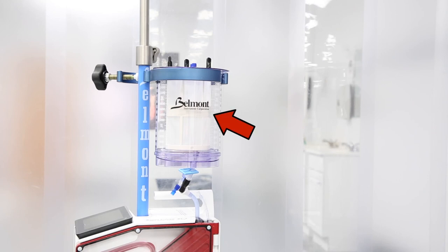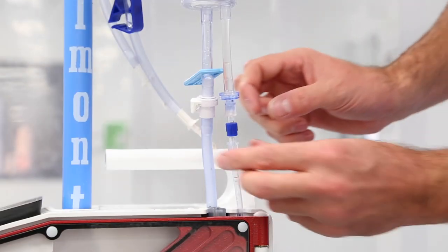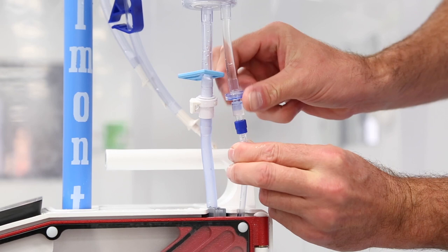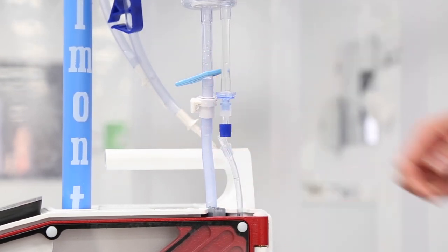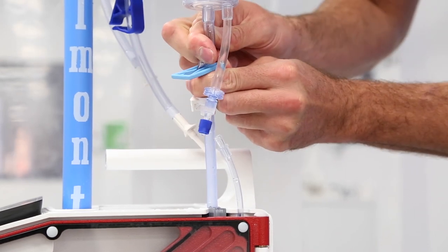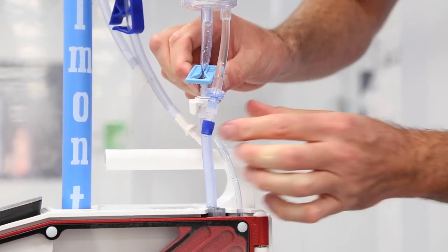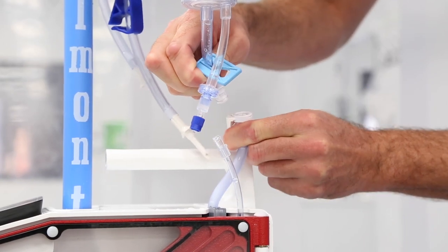The optional large volume reservoir can be added at the beginning or anytime during a procedure. The LVR will hold up to three liters of fluid, has five fluid spikes, and can be added to the system in less than one minute. Disconnect the small reservoir by unscrewing the lower fitting on the recirculation line. If the small reservoir contains fluid, close the blue clamp to prevent a spill before disconnecting the fluid line. Disconnect the fluid line by pressing the quick release tab while separating the fluid tubing.